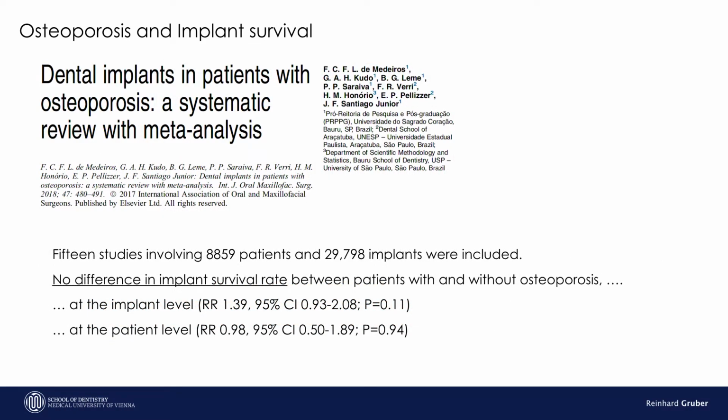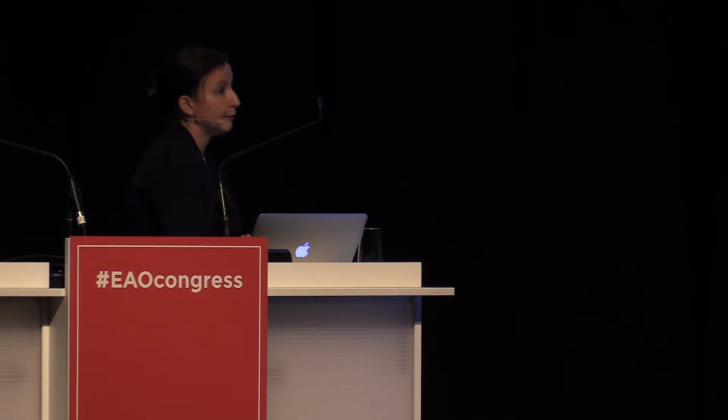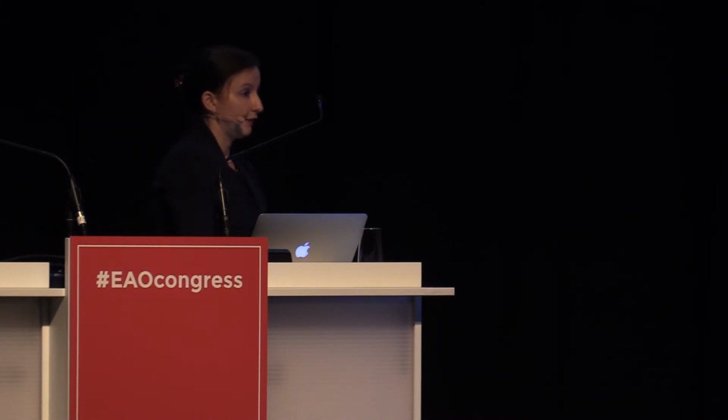But when you look at the survival rates in this recent review, which was published in 2018, you see that there was no difference in implant survival rates. So I think this is the result of what we learned in the last years, and maybe the implant survival rate is in the literature at a very good level because we learned in the last years from anatomy that osteoporotic patients might have a risk of implant failure.